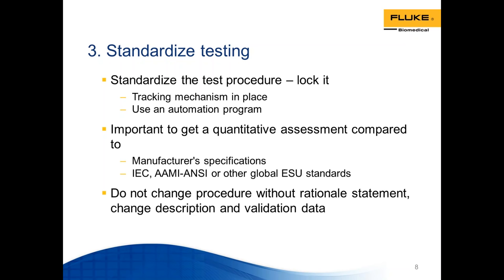In fact, it's important when you consider traceability and the unbroken chain of traceability of the medical device, which has been tested by the test tool that you're using, the test instrument, which is traceable all the way back to SI. That's the traceability path. And it's important to understand, therefore, whether the measurement that you're making is in or out of specification.